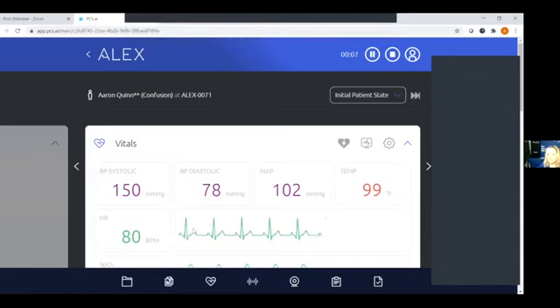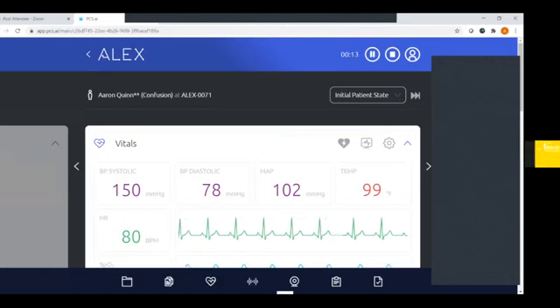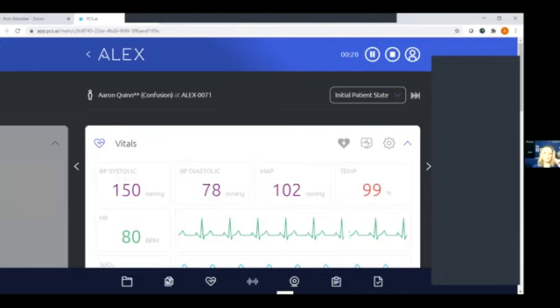Does anyone have any questions? I have one question from back when you did the head to toe, Angela. The question was, can we use a real stethoscope? You can. What you'll do is you'll put a real stethoscope through, grab the scope and I'll bring it.